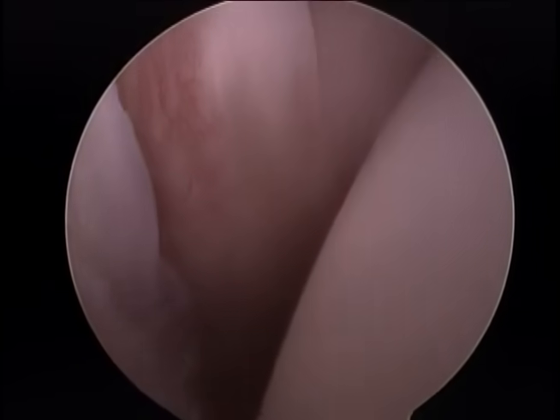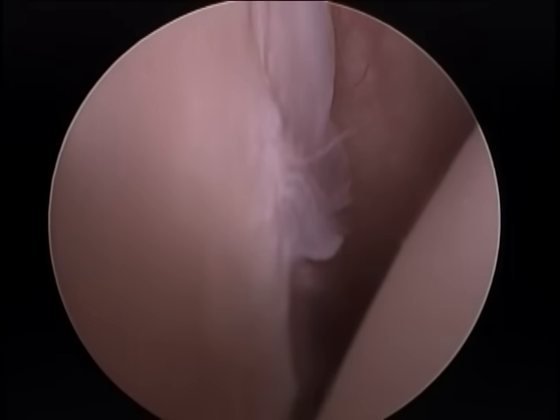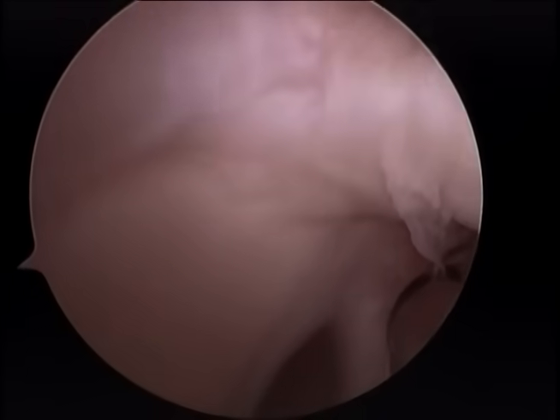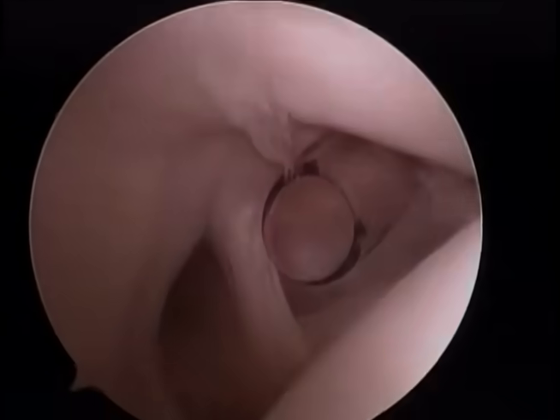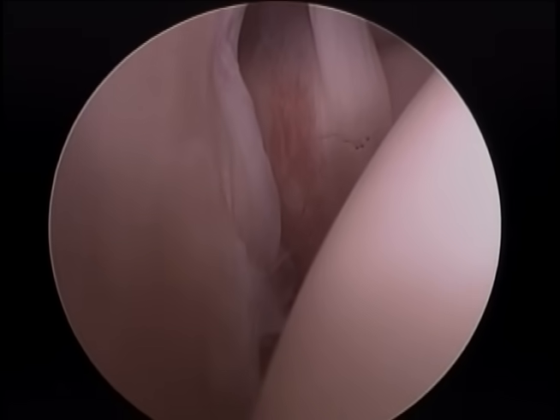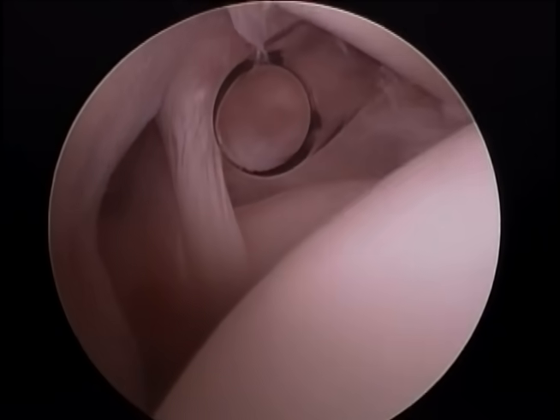We start our diagnostic exam of the shoulder. Humeral head is to the right and the glenoid is to the left. This is the anterior labrum, a little tattered but not detached. We slide into the axillary pouch. We then bring our camera up the back of the glenoid, and now we visualize the long head of the biceps. We again focus on our anterior labrum, and just to the right, the thick band of tissue is the middle glenohumeral ligament. Beneath the cannula is the subscapularis.